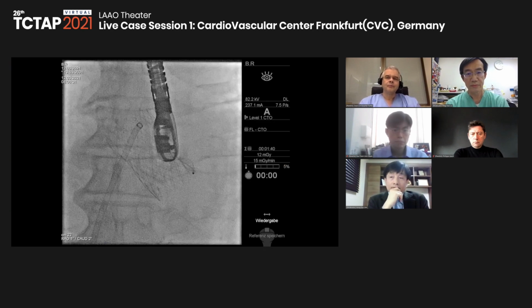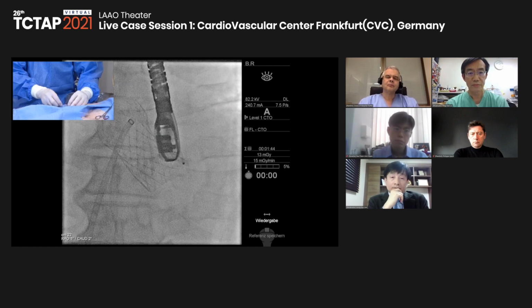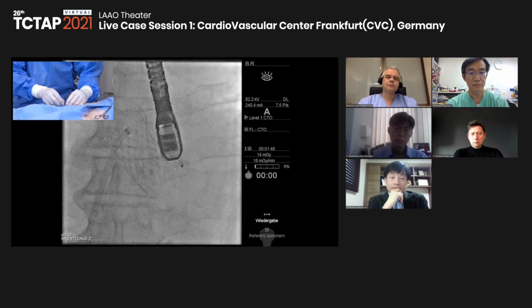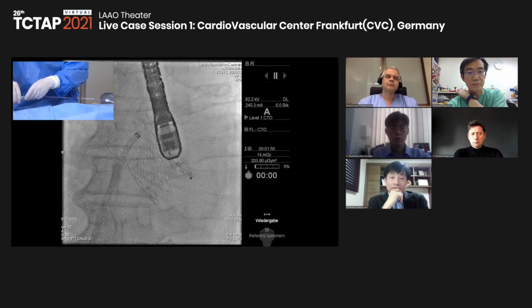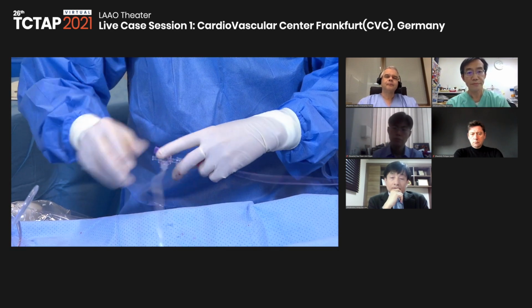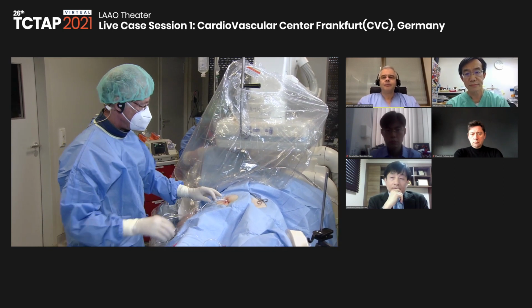This patient has a very long pulmonary ridge. So the ridge between the appendage and the pulmonary vein is very long. So this is probably the pulmonary vein. And I see this on TEE as well. I will have to pull back, Horst, and go more.